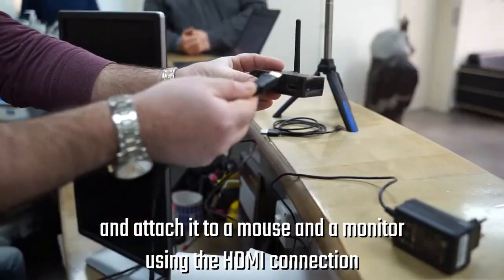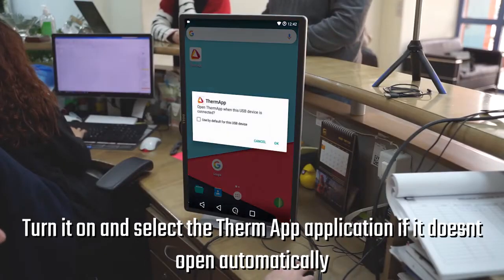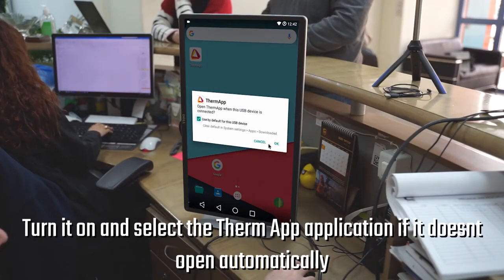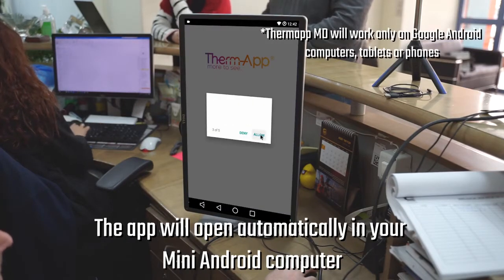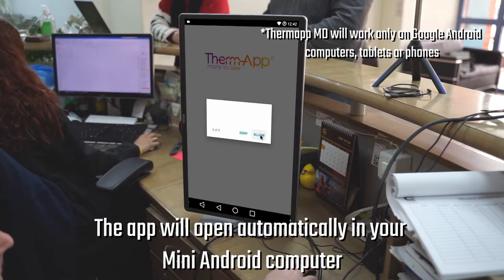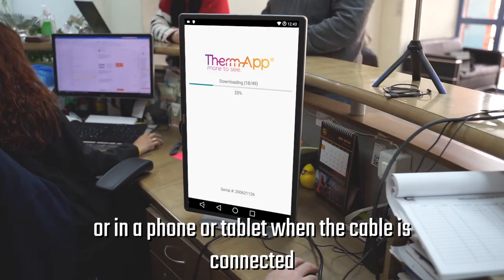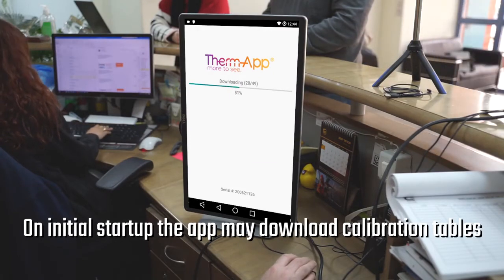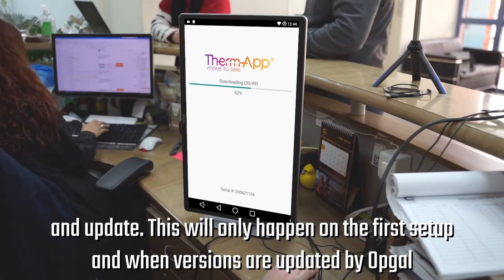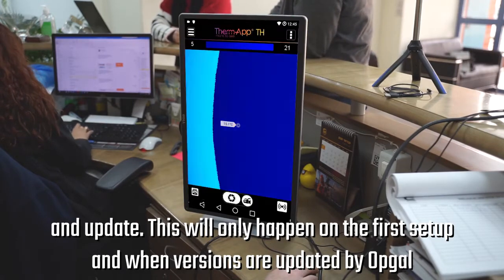and a monitor using the HDMI connection. Turn it on and select the ThermApp application if it doesn't open automatically. The app will open automatically in your mini Android computer or in a phone or tablet when the cable is connected. On initial startup, the app may download calibration tables and updates. This will only happen on the first setup and when versions are updated by OpGal.